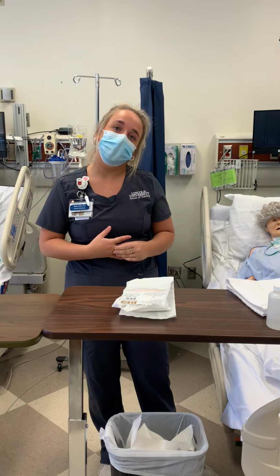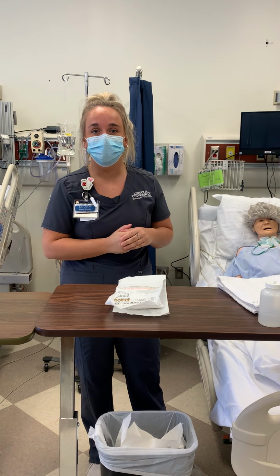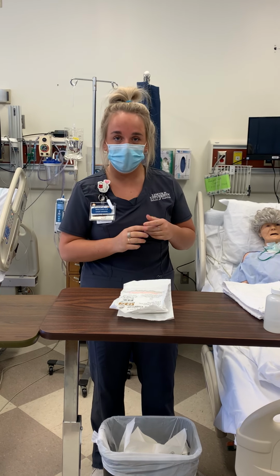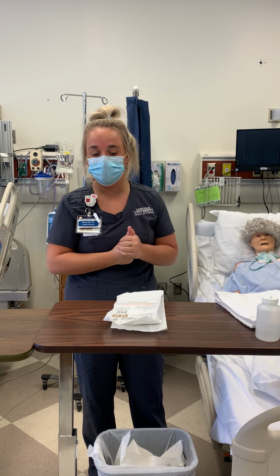My name is Lofaro. I'm a 7th semester nursing student. It's February 19th, 2021 at 9:30 a.m. and I will be demonstrating trach suctioning and total trach care on my patient today.